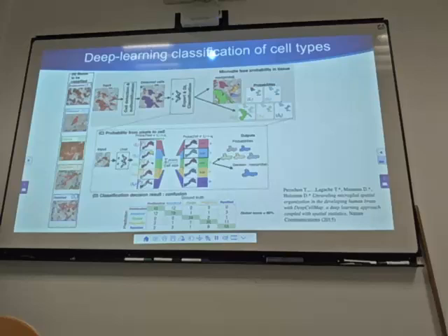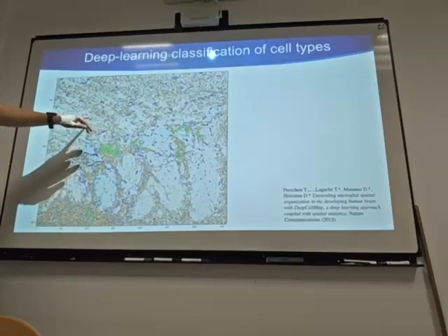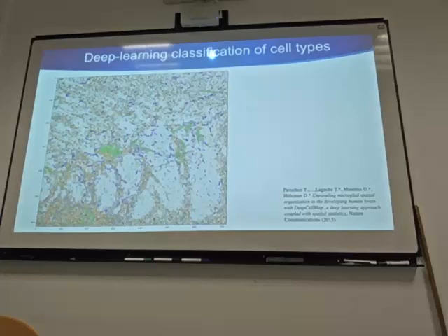But you can also keep the probability information and say that this structure has a probability of 50% to be proliferative, and 30% to be amoeboid, and 20% to be cluster. We have also derived some statistics to account for these probabilities. And this is the type of result at the end of tissue imaging that you have. And you see that here clearly you have big structures that look like points, and then you can clearly analyze, for example, the accumulation of one type to another, etc.